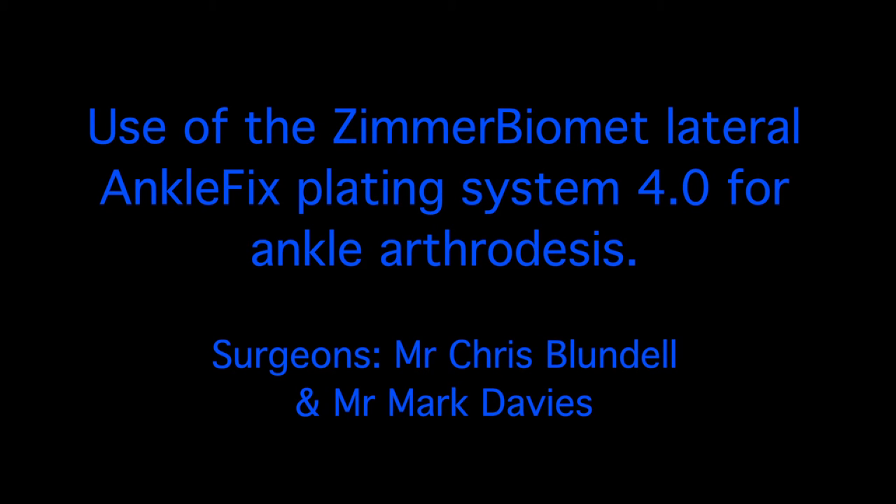Welcome to this video demonstrating the surgical technique for applying the lateral ankle fixed plate for ankle arthrodesis.